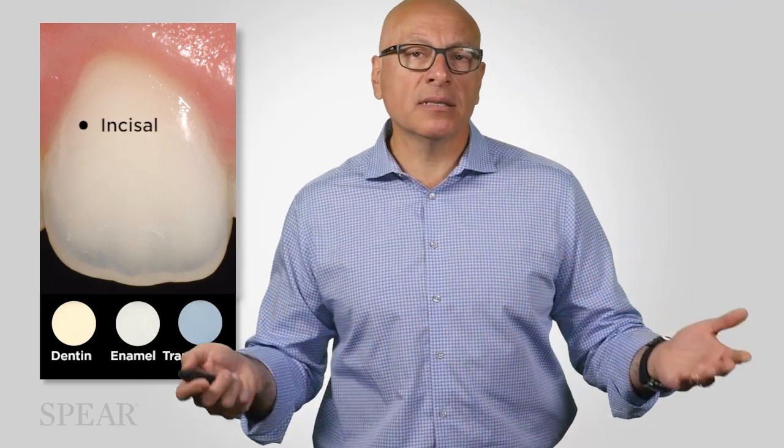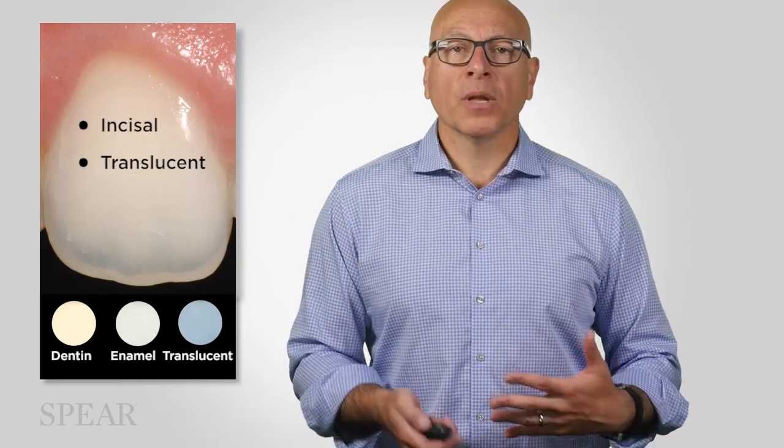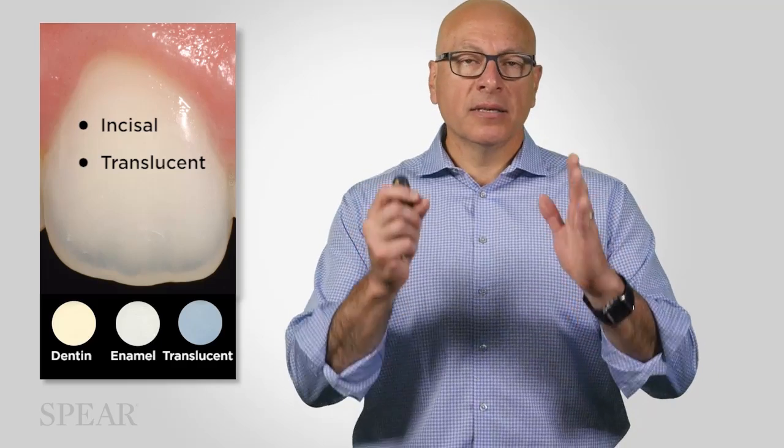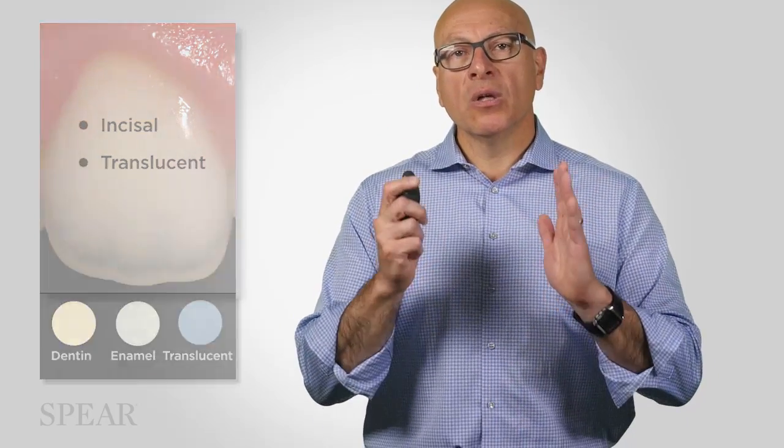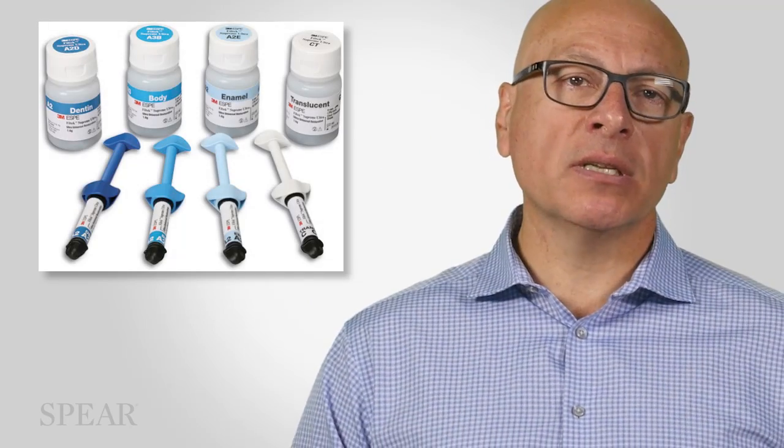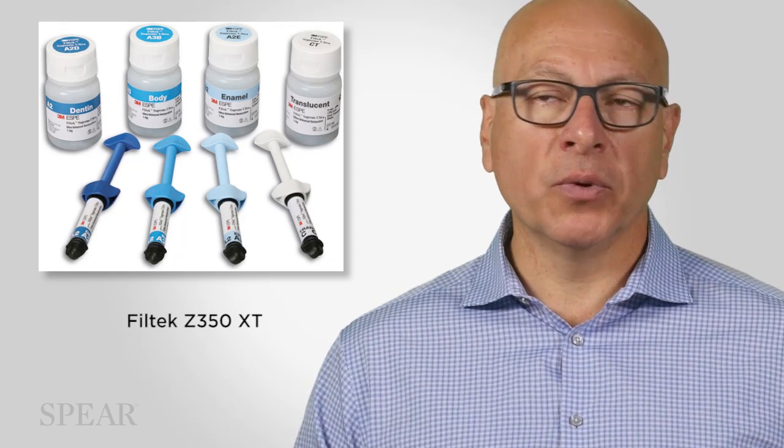Some of them are incisal, they're called translucent. It's a little easier. Again, know what the intention of the manufacturer is for you to use. Just as examples. And you can see one example here is Filtek Supreme Ultra.